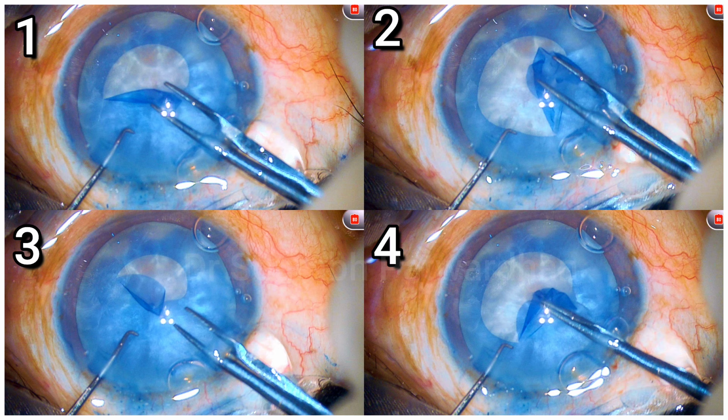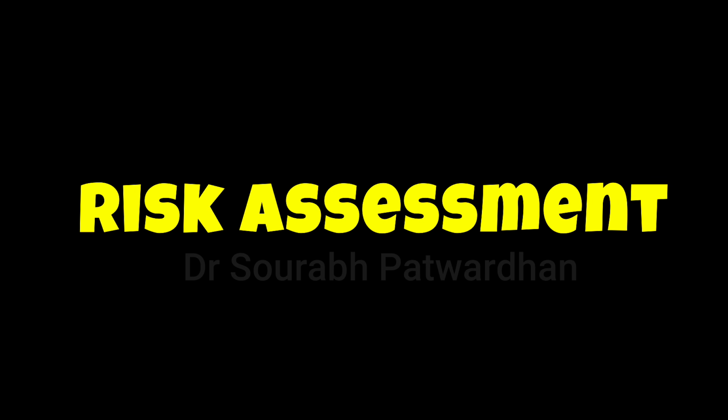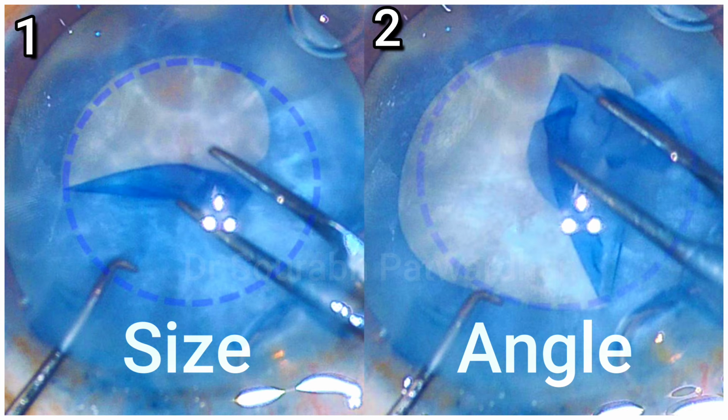So if we analyze the risk, you will find the pictures 1 and 2 had the high chance of extension, and you can see because the one is becoming larger than what is required, and that's when, if you go back and see, the surgeon corrected the course by pulling it centrally. And second is it's larger at the same time.